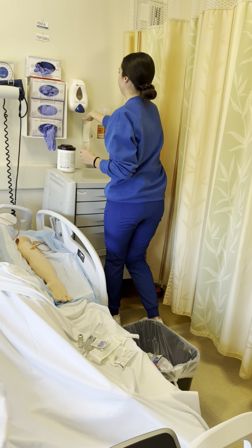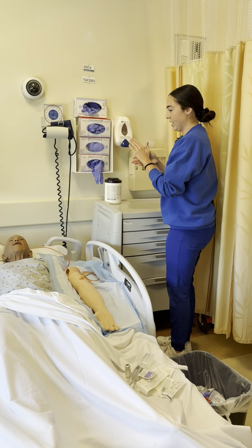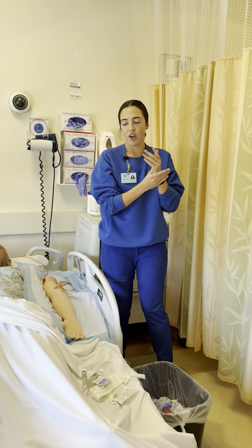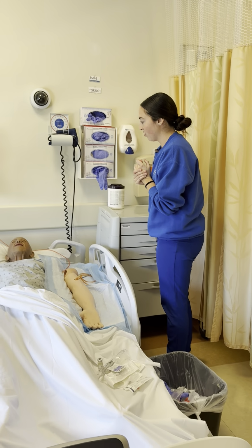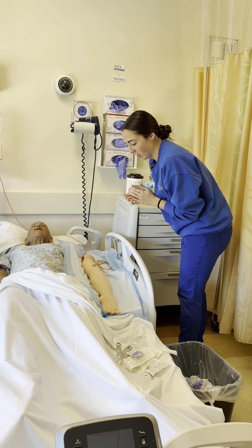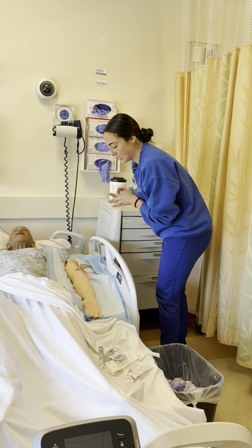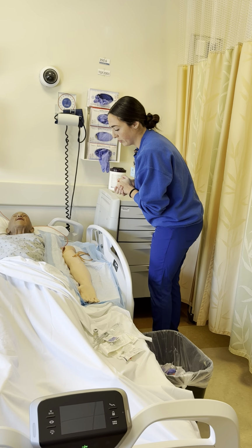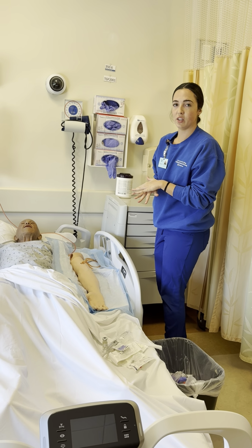Okay. I'm going to put on my hand sanitizer. I'm going to pull up the patient chart. Okay. Can you verify your name and date of birth for me? Ivy Armstrong, 39964. Okay. And then do you have any allergies, Ivy? No allergies. Okay, so Ivy is only allergic to latex.